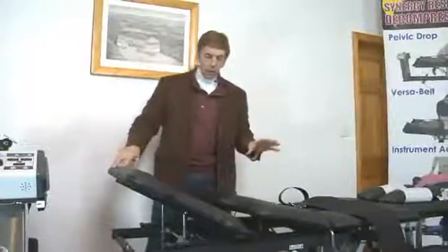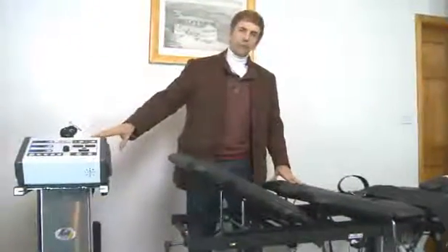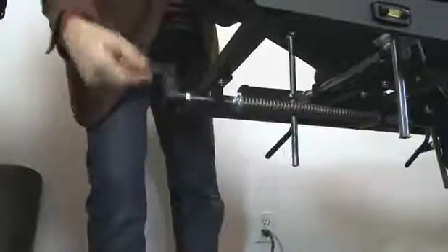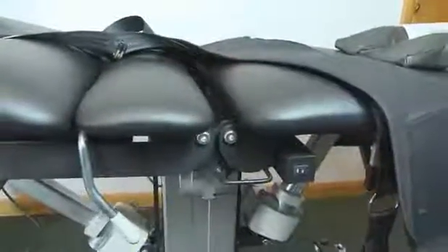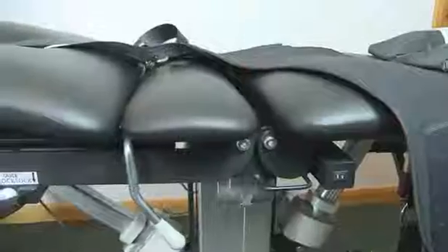perception of pull. When the patient does not feel that the pull is sufficient, instead of immediately going to the motor and increasing the force, what we can do is alter the tension on the spring so that the table will move more in the caudal plane when the patient is being tugged on. So the patient in one pull may say, "I don't feel much." We then back the spring off slightly, and now the patient's lower body will move with the table and their perception of pull will be increased.